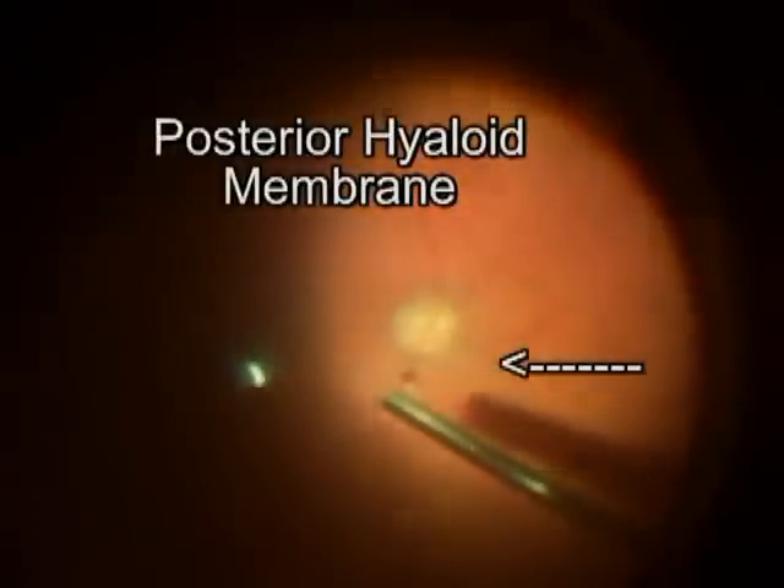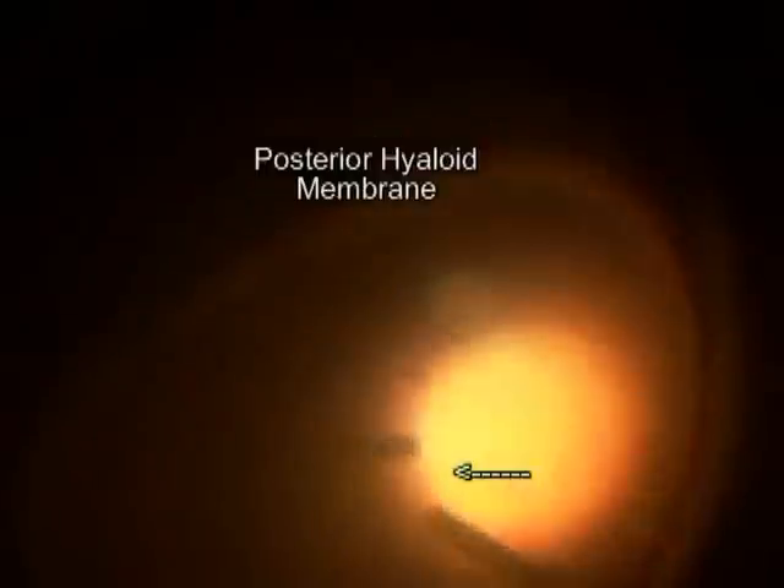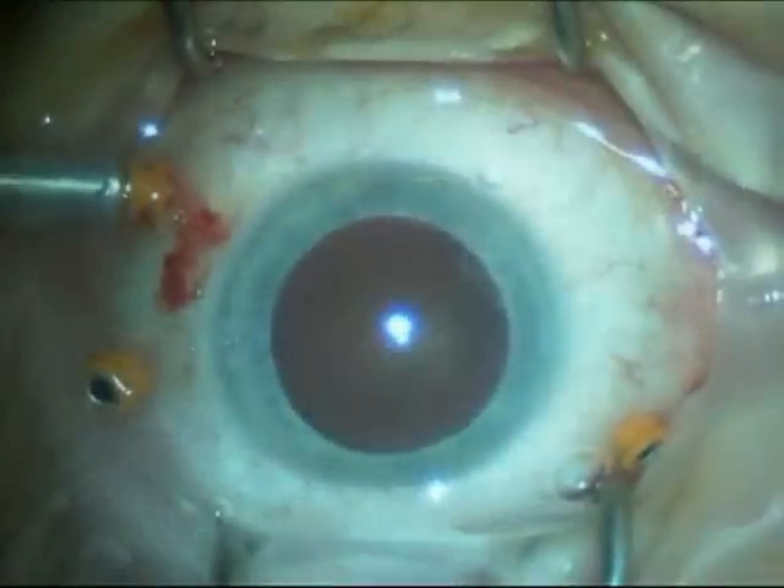I'll put some labels in the video to show you some edges of the membrane to help with visualization of the layer. The view through the microscope is better than what we can capture on the video camera, even though we do have a high-quality video chip available in the operating room. At this point the posterior hyaloid membrane is almost completely free of the posterior pole. Here you see in the light projection the shiny surface of the hyaloid, and you can see the stringy back surface of the vitreous as it's pulled free of the retina and subsequently removed.